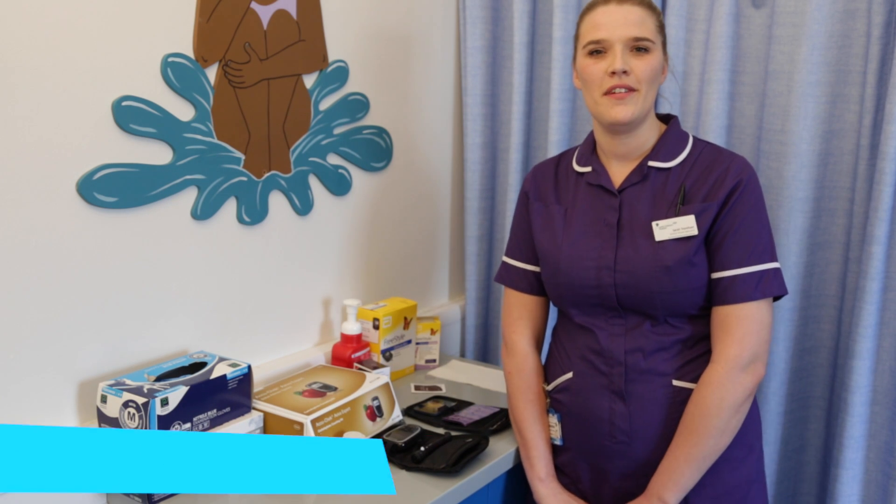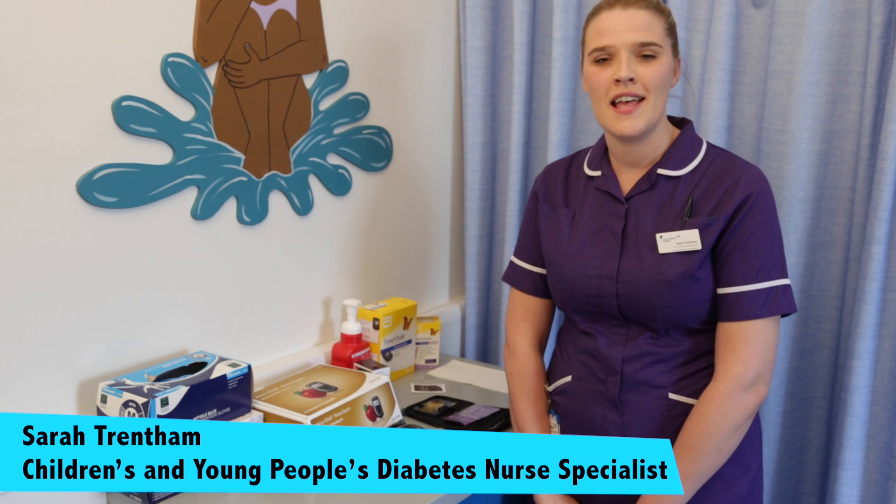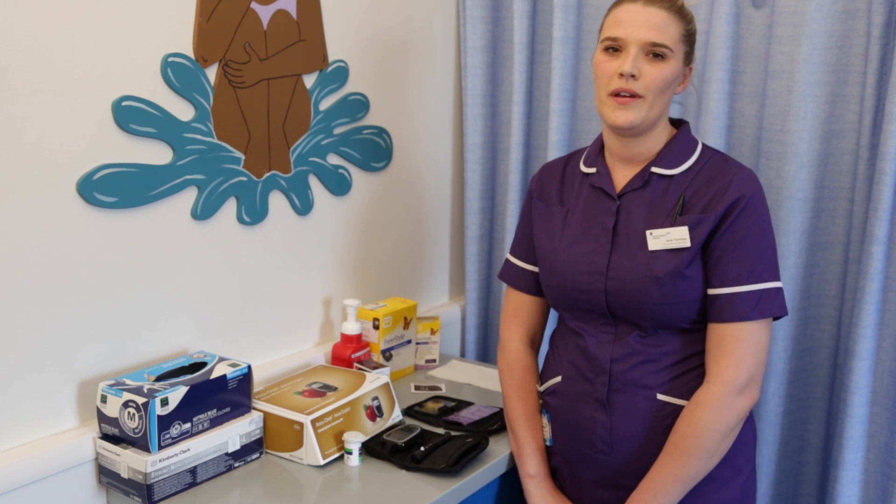Hi, my name's Sarah. I'm one of the children and young people's diabetes nurses here at the Leeds Children's Hospital, and I'm talking to you this morning about blood glucose checking.